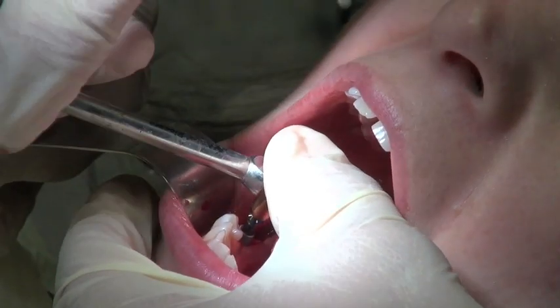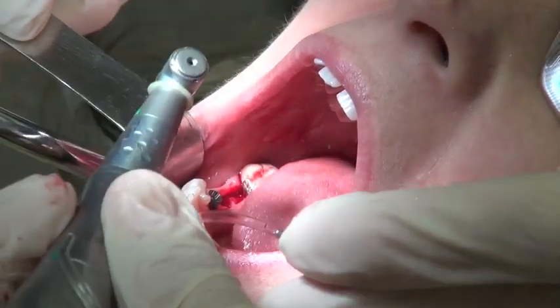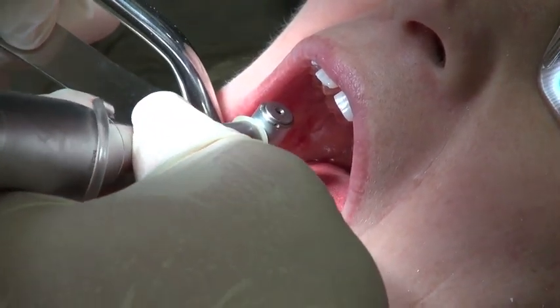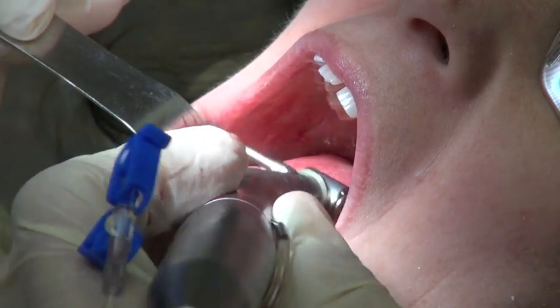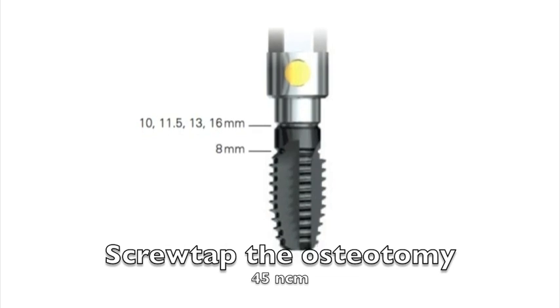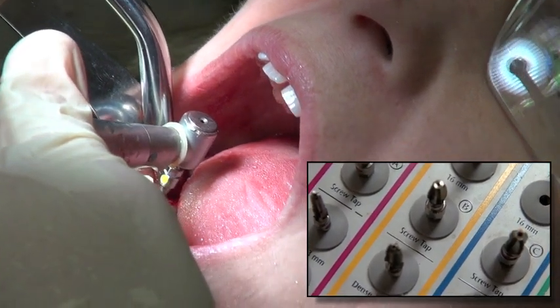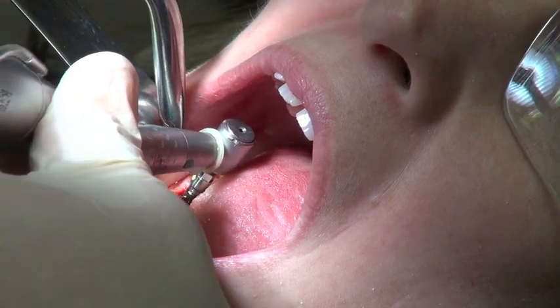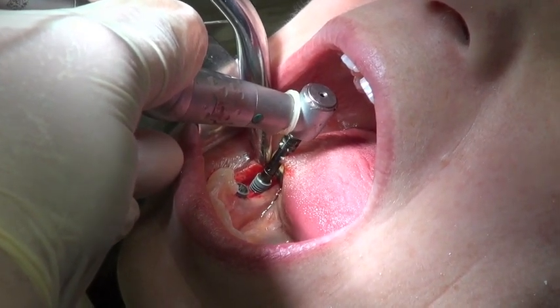I'll de-torque and reverse the torque wrench to take the implant out, then use the driver to remove it and keep it sterile by placing it back in the case. I'll go to the screw tap and tap this osteotomy — the tap is used very slowly, not at high RPM, as it's designed to prepare the osteotomy in a thread pattern. We're doing this because the cortical bone is quite dense in this area. We can't use a dense bone drill on a shorter implant like this, so we need the tap to allow the implant to seat properly.